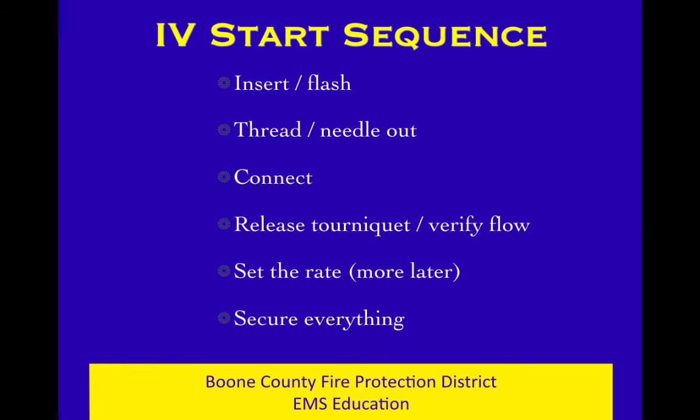Then we'll set the rate. Going to talk about that briefly here and then a whole lot more later, and you tie everything down. So it's really not difficult in terms of the number of steps. The steps should be in a logical order. You should do them the same way every time. And it's important that you then remember just a couple of things.